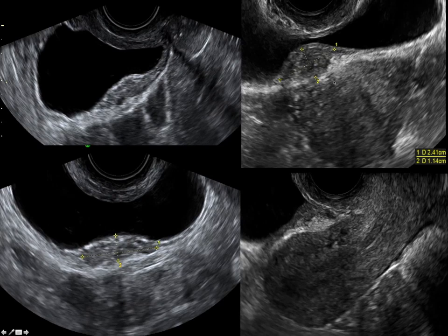Hard to tell because everything is fused together here and stuck together. These patients obviously have pain in urinating, and these are two cases of fairly extensive bladder wall endometriosis.